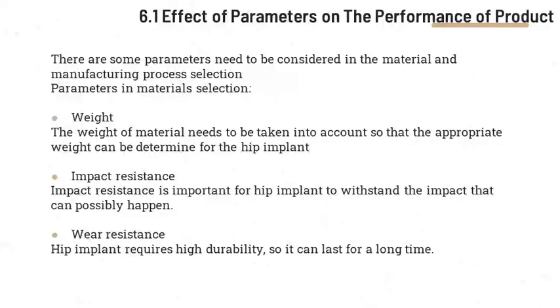Then, impact resistance. A hip implant has to withstand considerable stress so it can withstand the possible impact that could happen to it. Third is wear resistance. A hip implant requires high wear resistance so it can last a long time as an implant in the body.